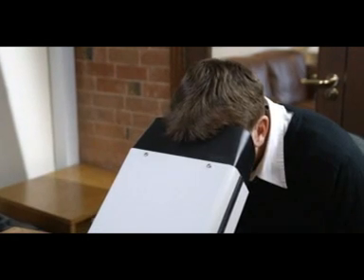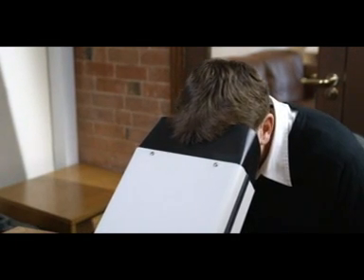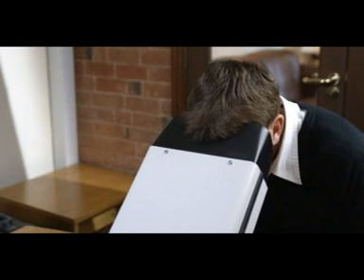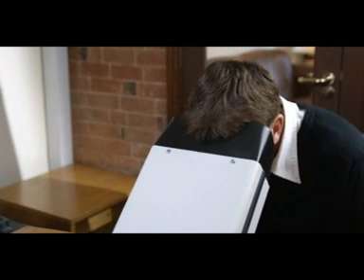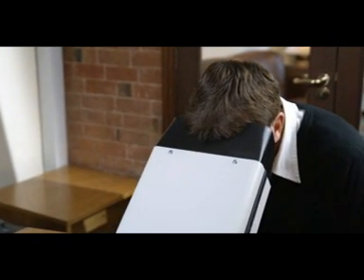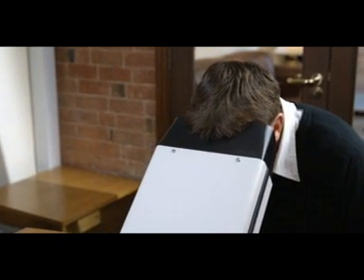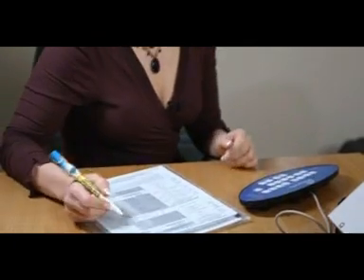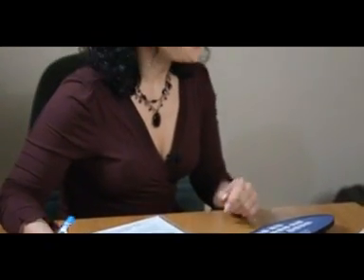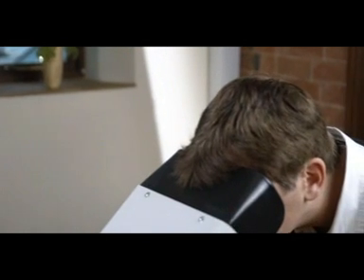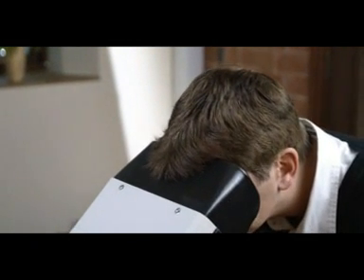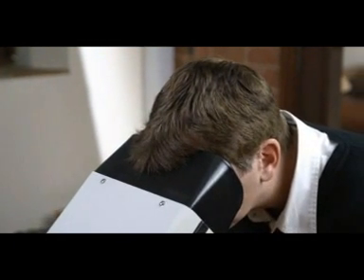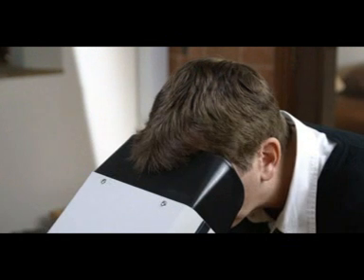At this point, the peripheral vision test should now be conducted. You do not need to press the ADVANCE key again for this. Steve, can you stay focused on the test panel please? Now I'm going to conduct test 13 straight after test 7, so can you please stay focused on the colored circles?